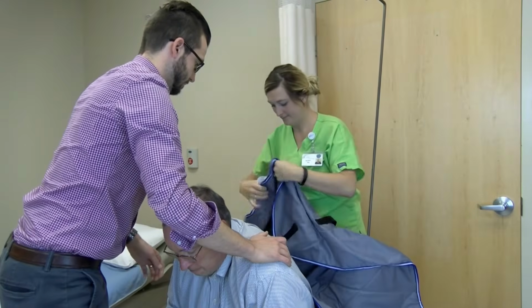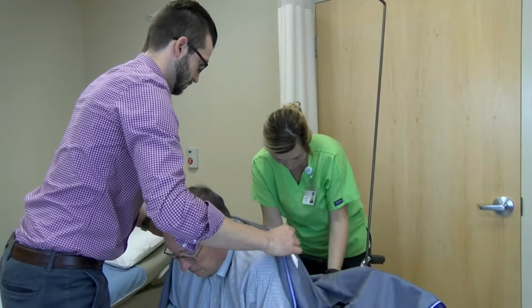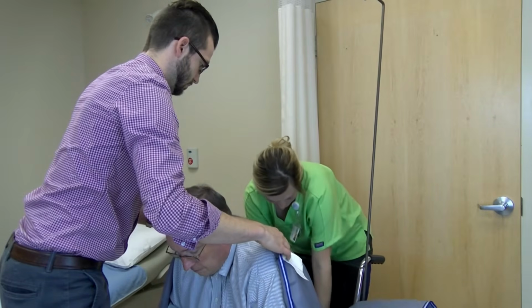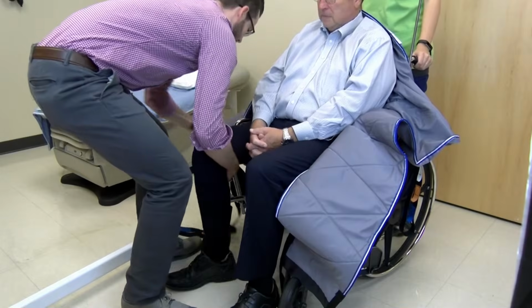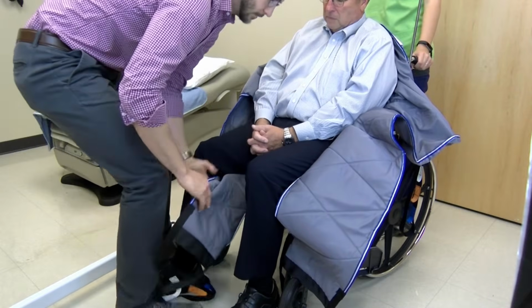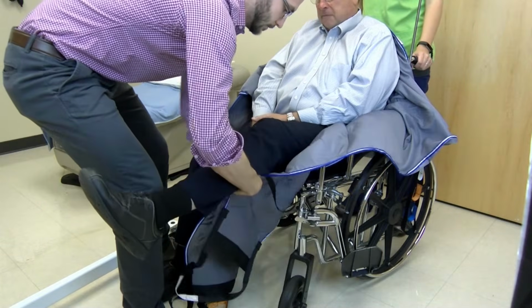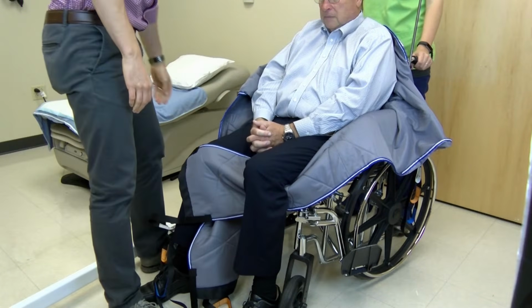Place the sling behind the patient with the smooth surface against the patient and the handles on the outside, making sure to place the opening close to their bottom. Lean the patient back in the chair. Lift one of the patient's legs and pull one edge of the sling under the patient's leg just behind the knee. Do the same with the other leg. You will want to crisscross the straps when attaching the sling to the Hoyer.